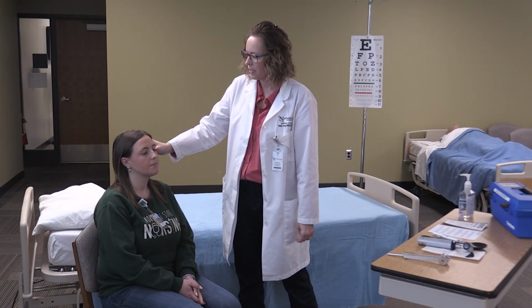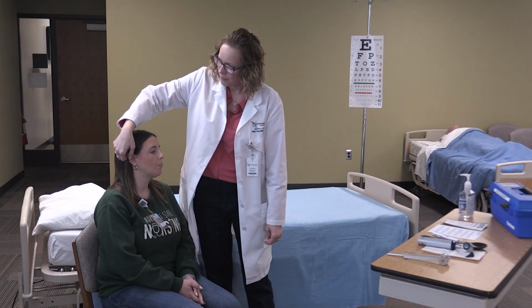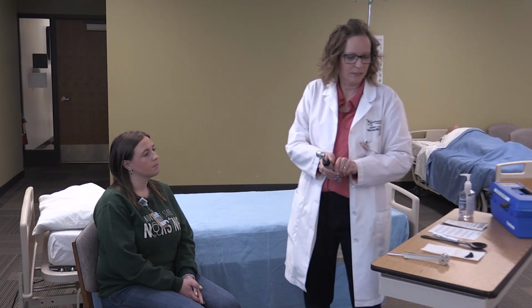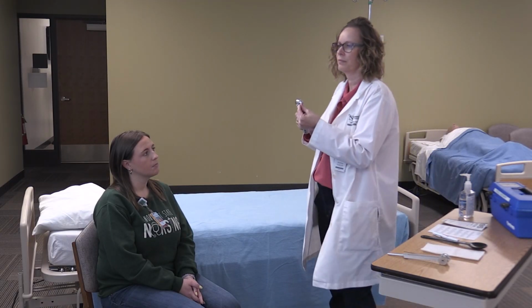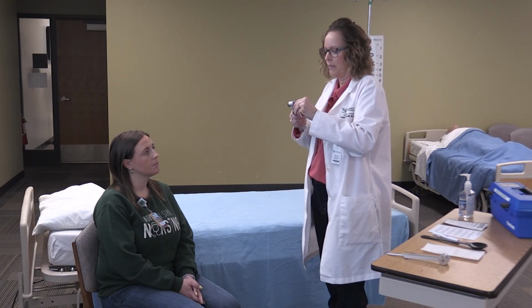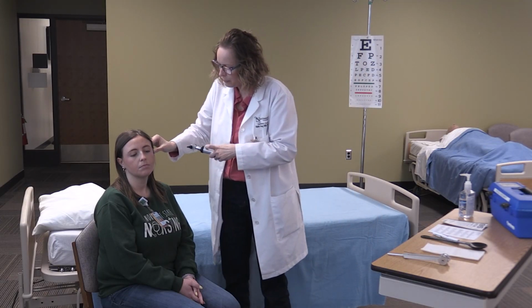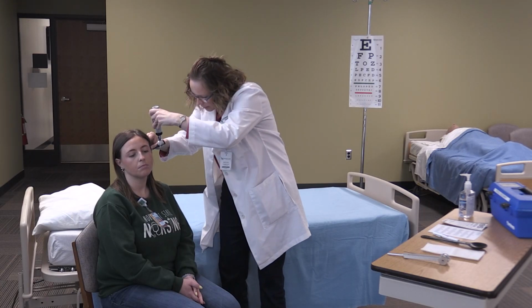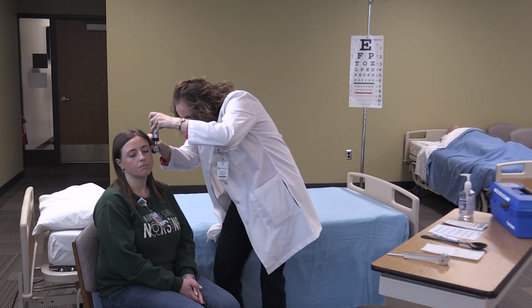Do you have any tenderness here when I palpate your ear? No. Okay. And then I'm going to take my otoscope and go ahead and pull back the ear pinna, pull it up and out, and then take a look inside.